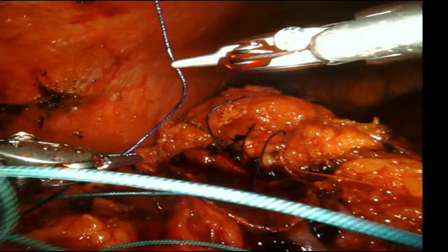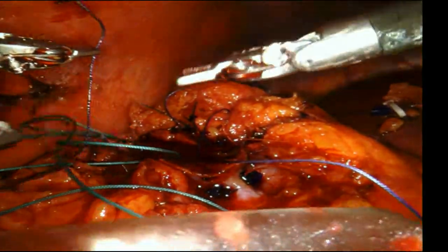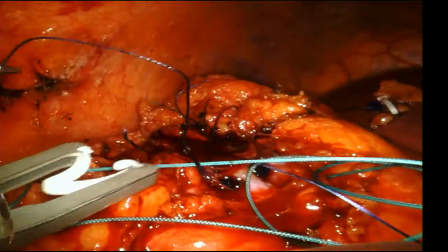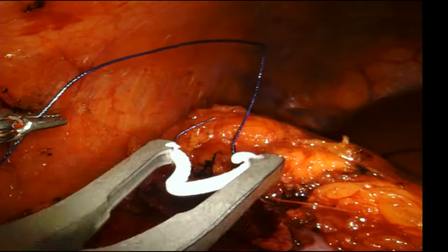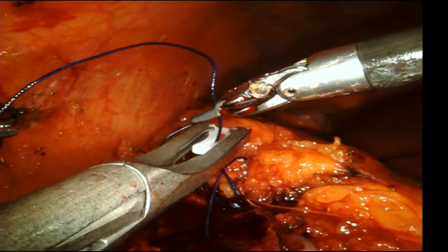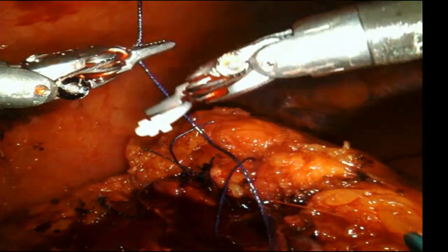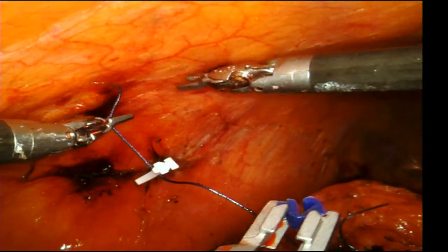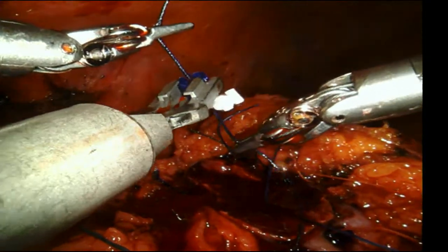So this needle is a CTX. Give me the strings, just put them in the body. The CTX needle is the largest needle that will go through a port, and it just barely goes through. To take it out, you'll see we'll have to bend the tip of it to get it out of the port. And then the XLH needle does not fit through a port. So how do we get it in? We get it in percutaneously. The bedside assistant will put it in through here, I grab the needle, I use it, and I send it out the same way. So that's the XLH, which is the largest needle.